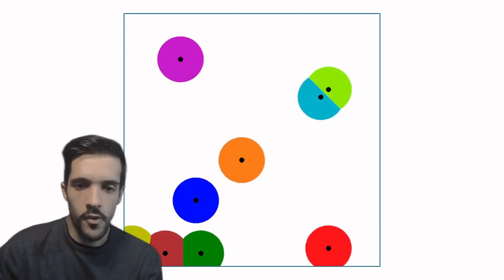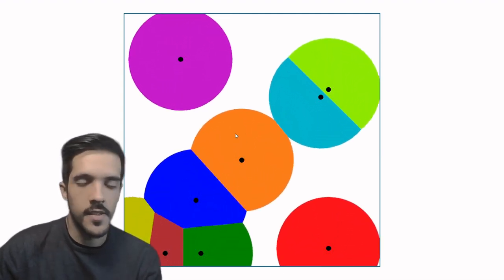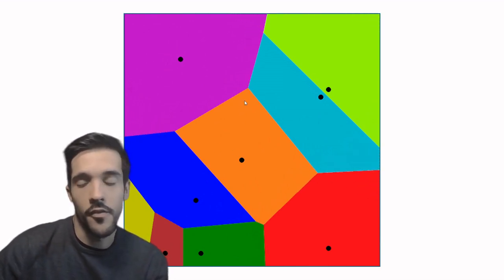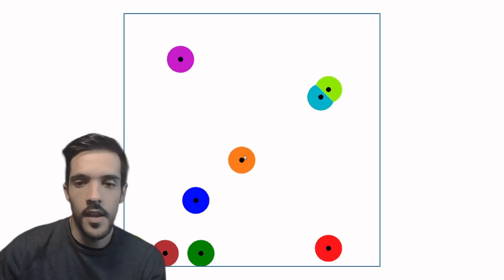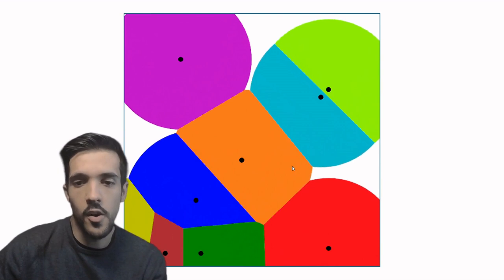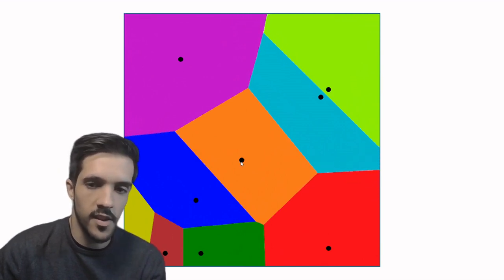The first step involves the StarDist plugin, which segments each nucleus, assigning it to a ROI. And then the center of mass of each one of these nuclei is used for the Voronoi tessellation, which is shown in this GIF, and which creates these kinds of weird polygons, which are simply the sets of pixels which are closest to the center of mass of the nucleus.